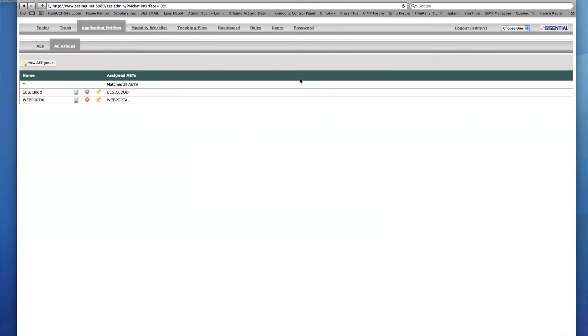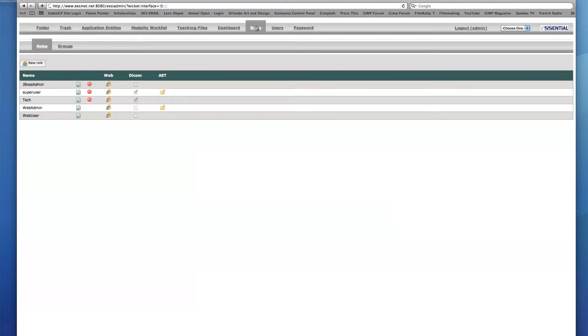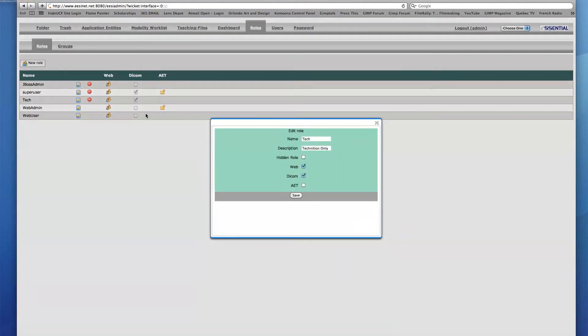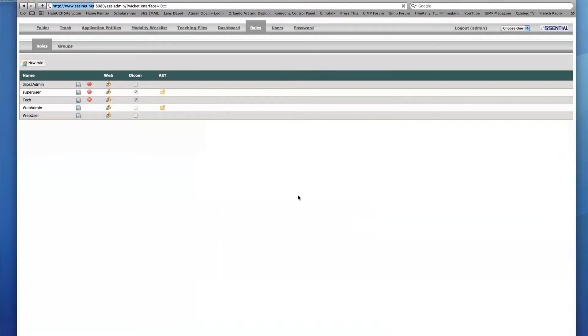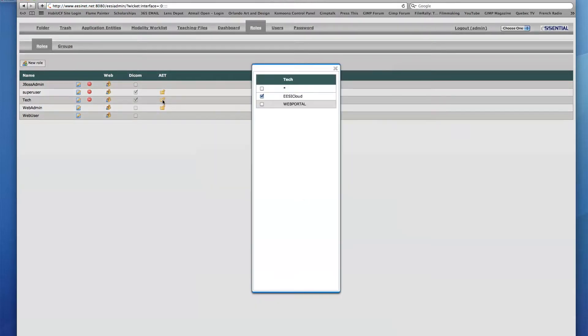Before I assign this AET group to my new user, I'm going to return to the Roles tab and enable the AET checkbox under the Tech role name. I will now click the AET icon in the Tech row and enable the checkmark in the box next to the new AET group.